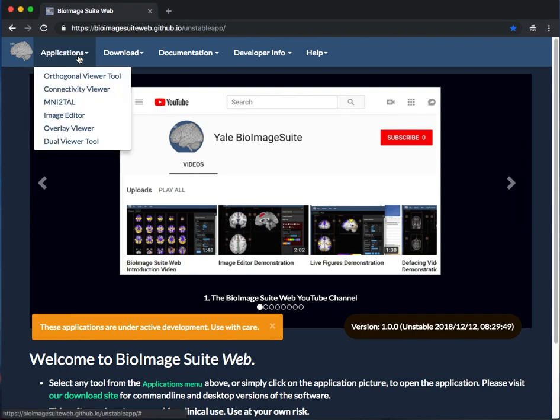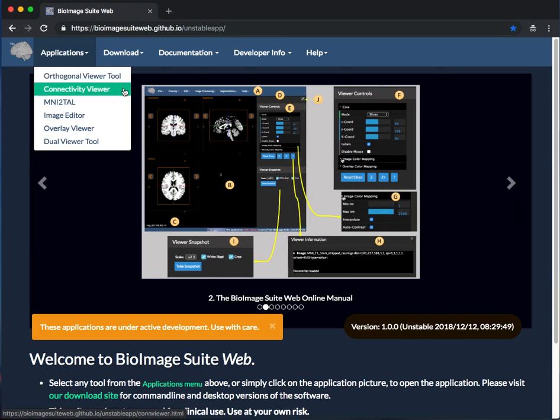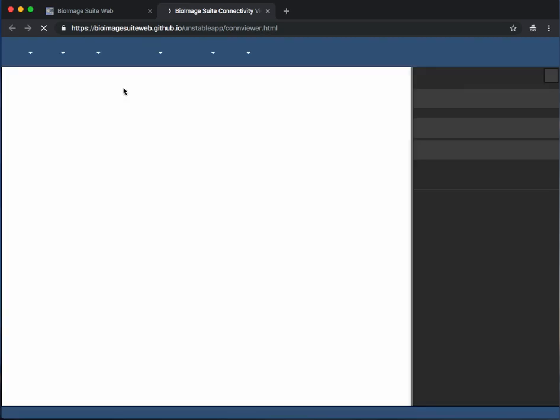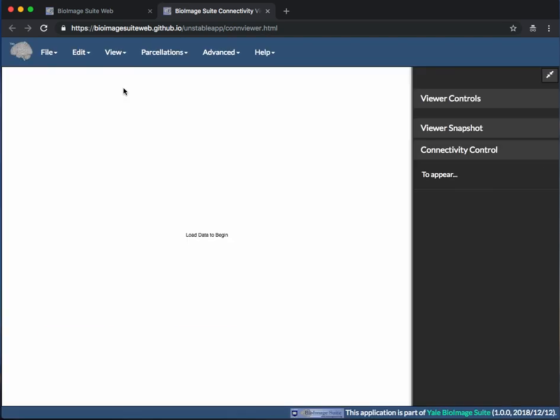First, go to Applications in BioImage Suite Web and choose Connectivity Viewer.